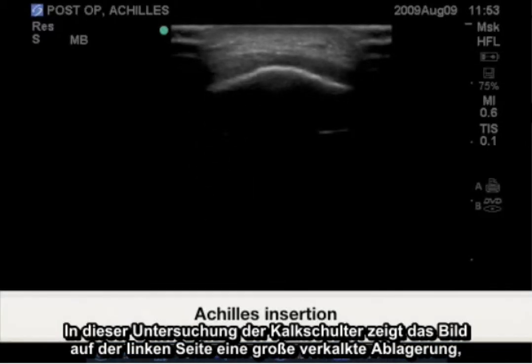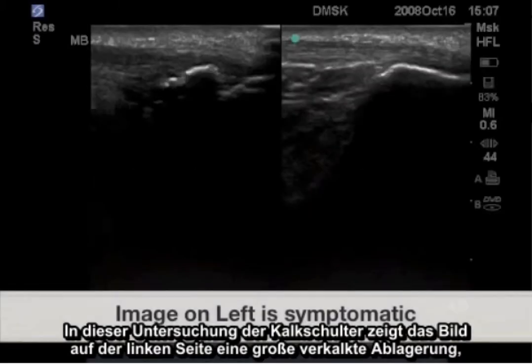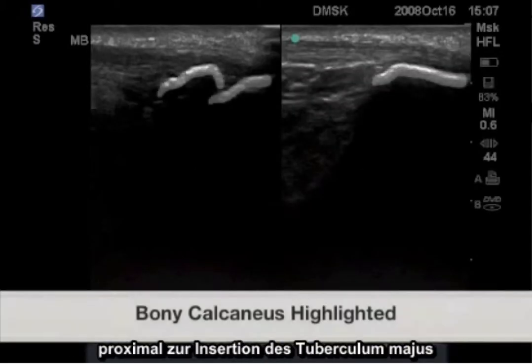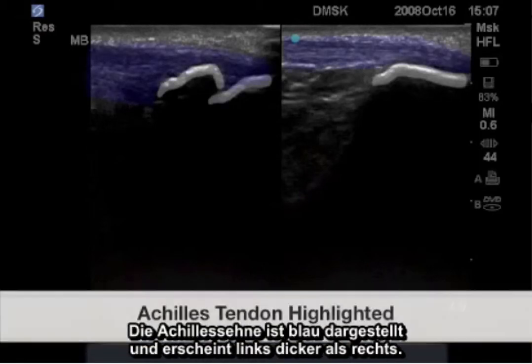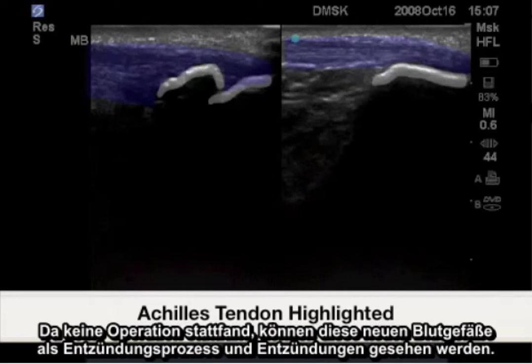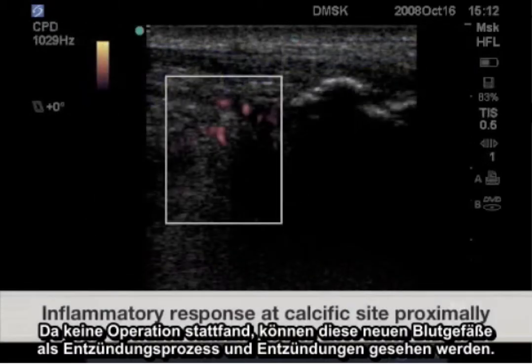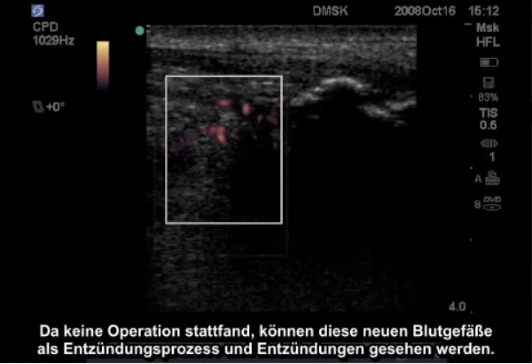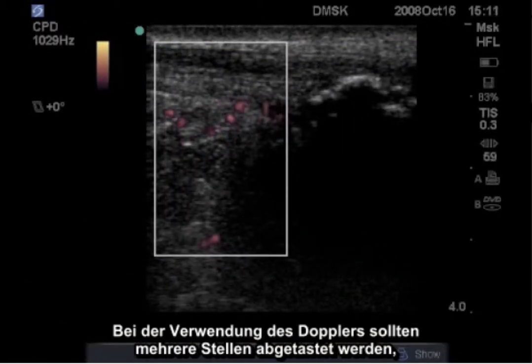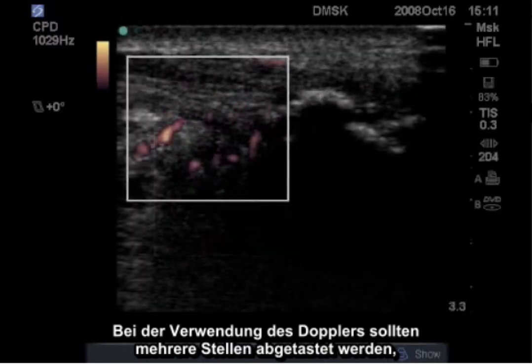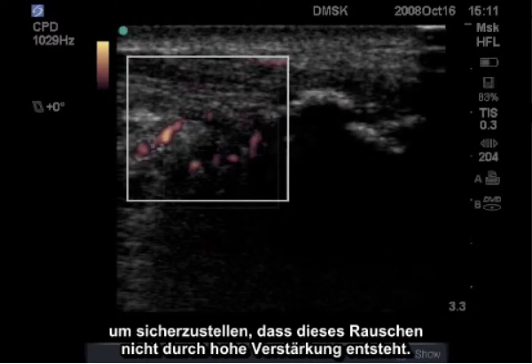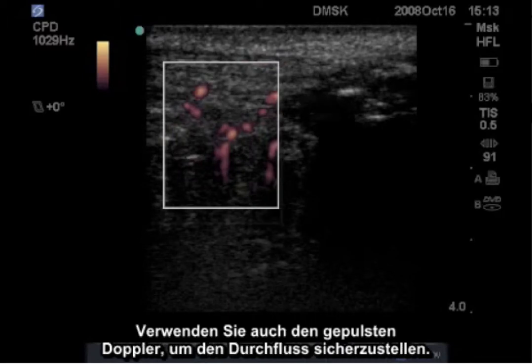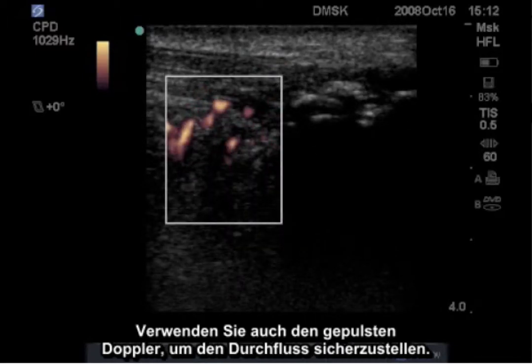In this calcific tendonitis study, the image on the left shows a large calculus deposit proximal to the insertion of the Achilles tendon, highlighted in blue, with the Achilles tendon noted thicker on the left image than the right. As we have had no surgery, these neovessels can be considered part of an inflammatory process. When utilizing Doppler, multiple sites should be sampled to ensure that this is not noise due to high gain. Also use pulse wave Doppler to ensure that this is truly flow.